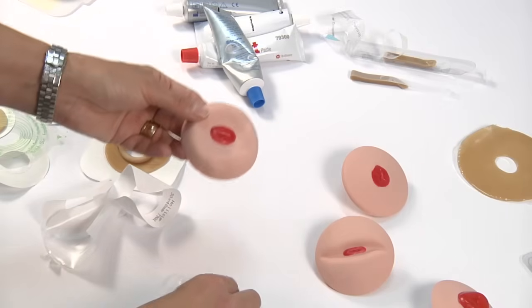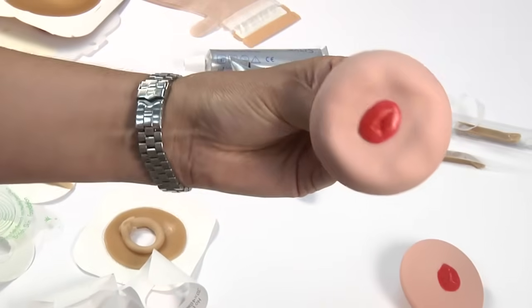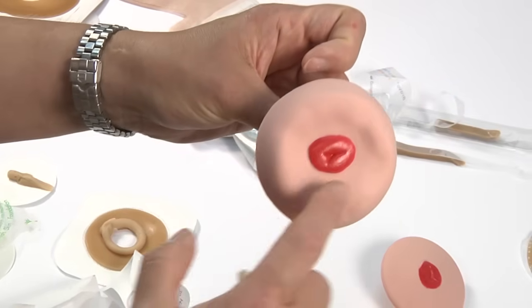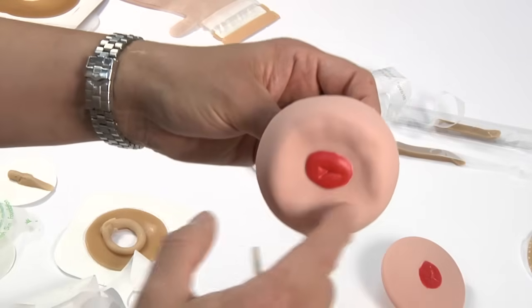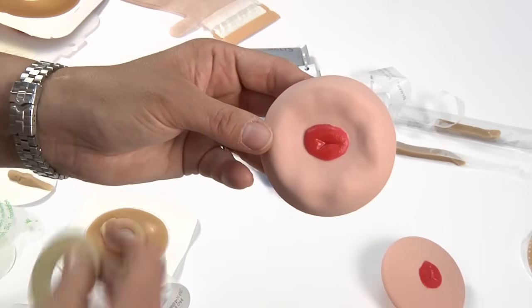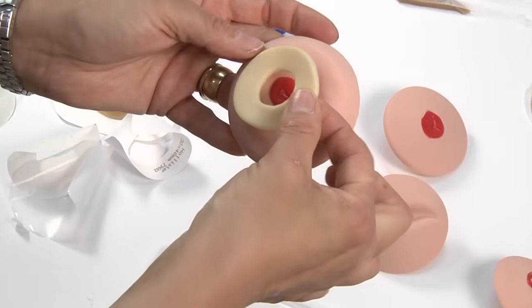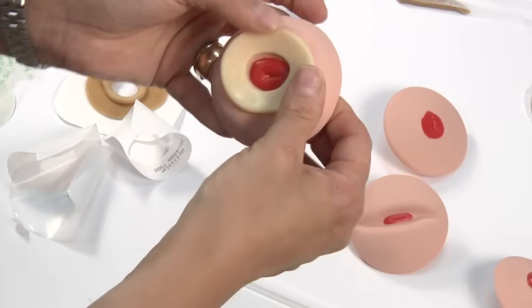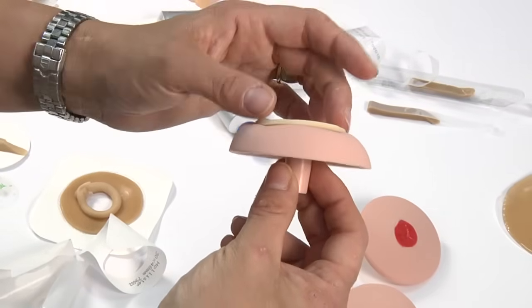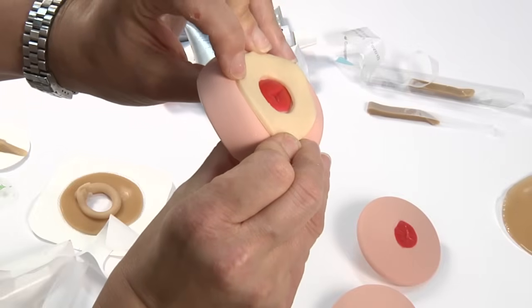Just going to go back really briefly to this, the utilization, as I said, of a barrier ring may be that you want to fill in curves and gullies. So if you look at this from the side, you can see that the stoma is within a gully, that it's under tension, and that you have a flush stoma. So you're looking for some degree of convexity to fill that in and compensate for this so that you don't have a leak. And that's where a ring may be sufficient for you, so you might be able to stretch that out. As I said, it's okay for it to fill the stoma, or to touch the stoma, but if you see how that fills in the shape, then you're going to start to appreciate whether or not you have enough convexity, and whether you've distorted those body contours sufficiently to get a seal.